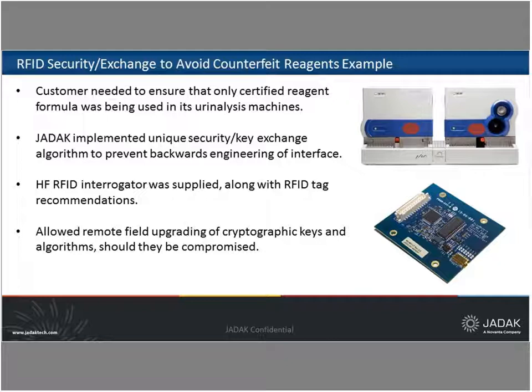In this case, the customer was concerned about what counterfeit reagents could do. Really it raised serious safety concerns and also financial concerns. It would impede the device's ability to verify and validate the test results. So this might result in the requirement for a patient to come in multiple times because of a misdiagnosis. And that never looks good for any company.